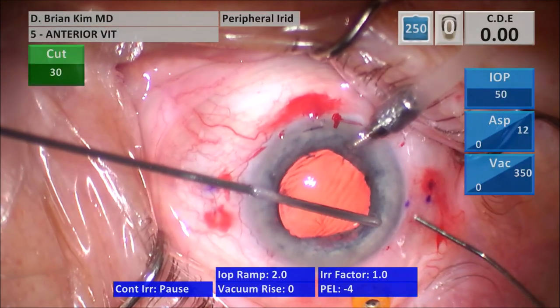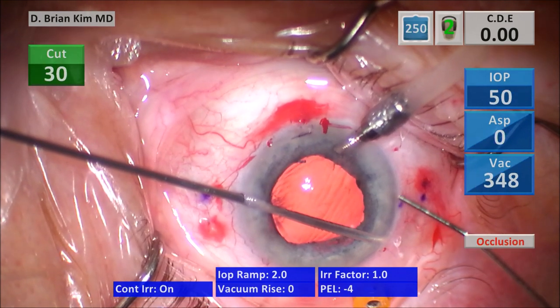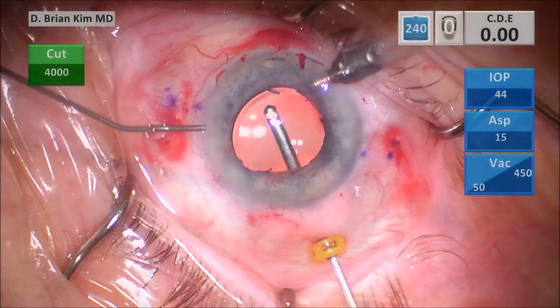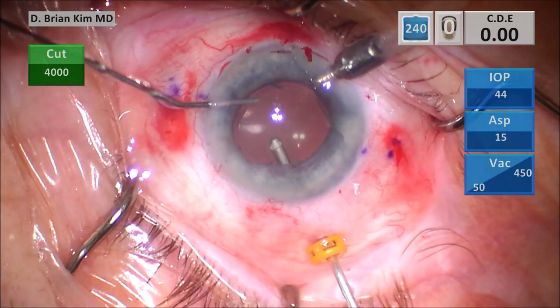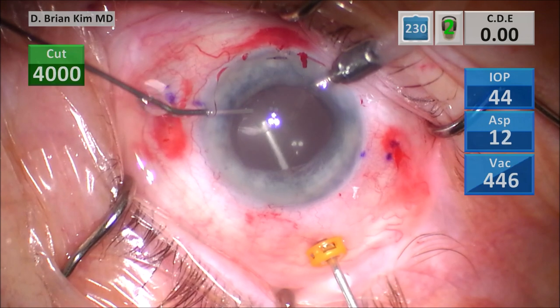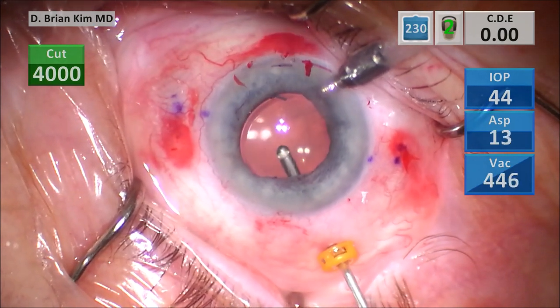I performed the vitrector-assisted peripheral iridectomy — a nice small focal PI in the periphery temporally. I'm injecting intracameral triamcinolone once again, with the vitrector through the trocar, pulsing the triamcinolone to make sure there's no additional vitreous in the anterior chamber.